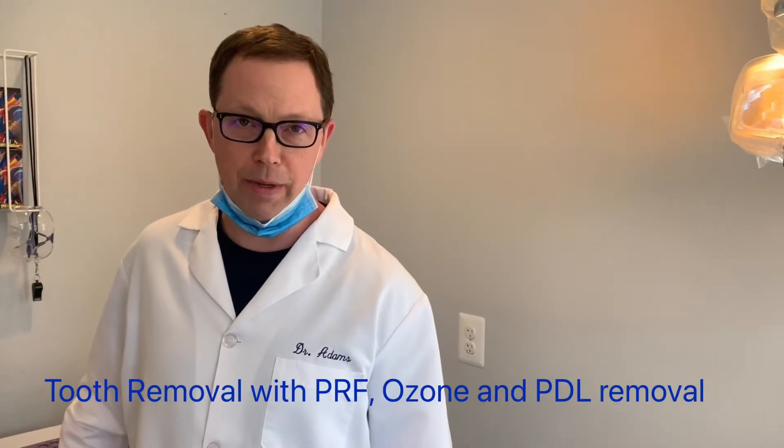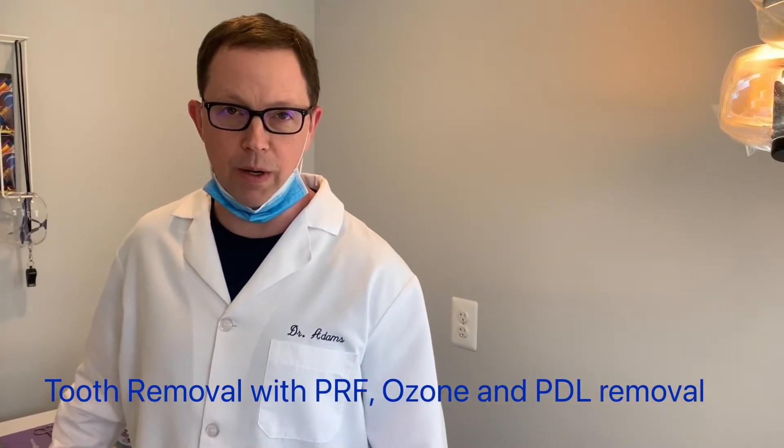Hi, my name is Dr. Adams and I'm a dentist at Maryland Holistic Dentist in Burtonsville, Maryland. Today I'm going to do a video about how to properly remove a tooth and clean it, treat it with PRF, and get the bone to grow properly back into the jawbone. There's been a lot of discussion about this, but this video will actually show how we do it.